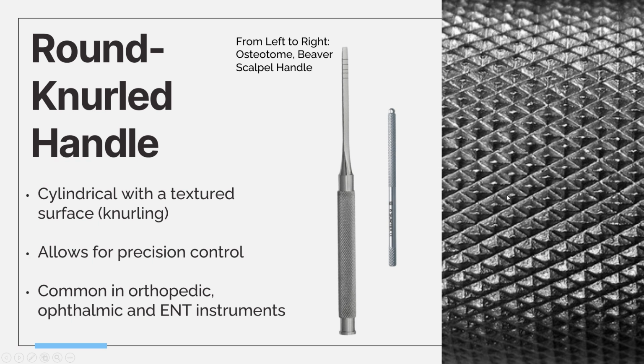They could easily get trapped in here, especially after, let's say, they finished the surgery and they left it out before it could go to decontam for a bit longer, especially if they don't pre-clean it, it will harden. The blood on it, all the bioburden, microorganisms, it will harden. These are actually among the trickiest instruments to clean, especially after an orthopedic surgery. There will be a lot of bone fragments and blood on these, dried up severely.